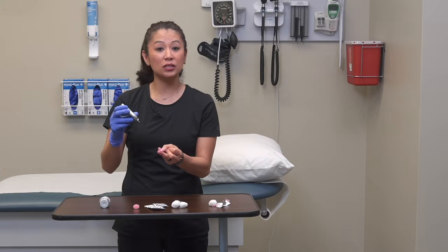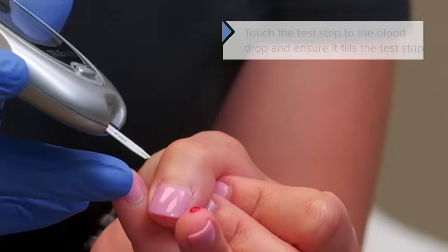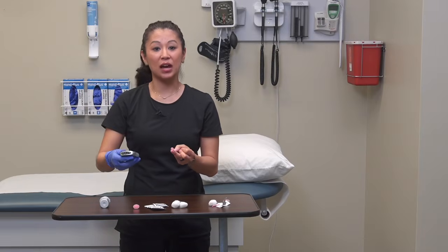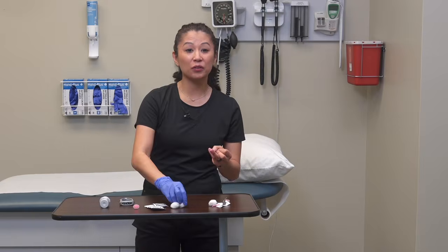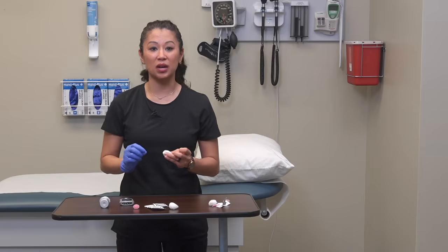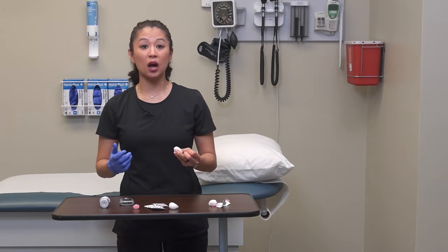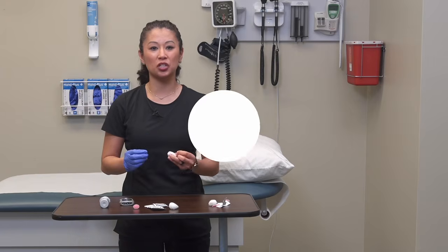So here's the piece about the test strip. We don't want to lay this on top of the drop of blood. We want to take this to the blood and make sure that it fills up our test strip. Now, once we've done that, we will get our meter to read. It'll start reading for you. Then after we've done that, we can go ahead and apply pressure to the puncture site as the results are being processed. Now, once that's done, we can read the digital display when the process is complete. And then if you're at home, you may end up loading that to a certain device. So we'll put it into the patient's chart.